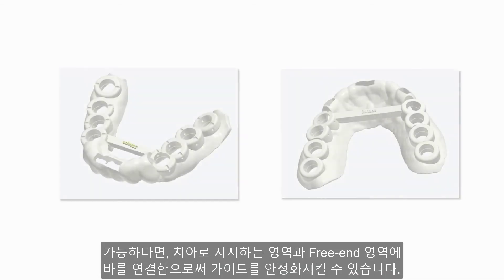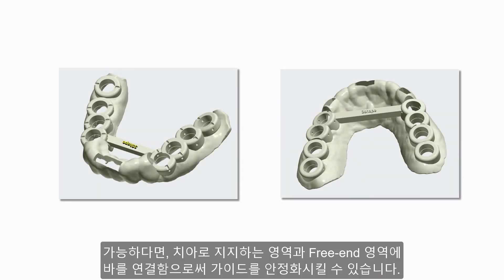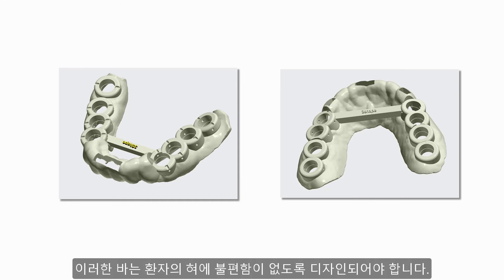If possible, stabilize the guide by adding bars from tooth-supported to free-end areas. However, remember to design the bars in such a way that the tongue can fit without any discomfort for the patient.